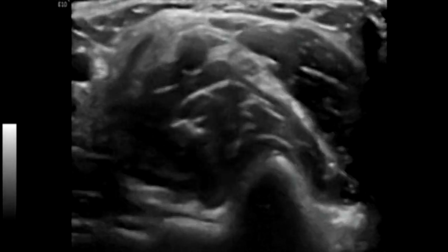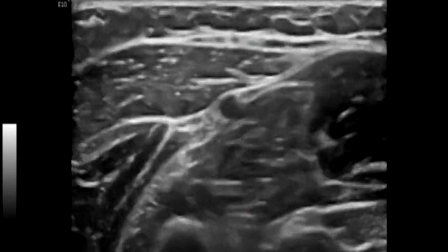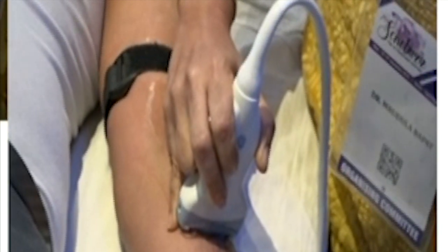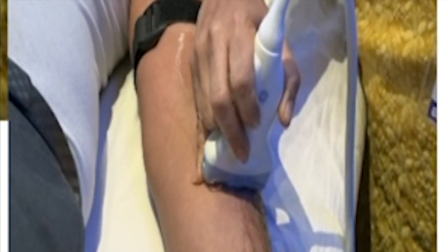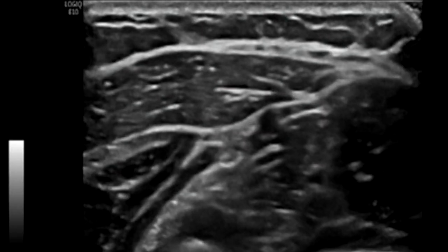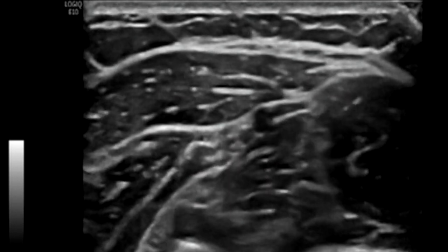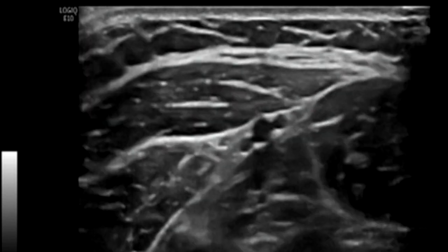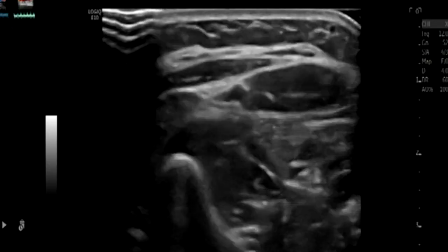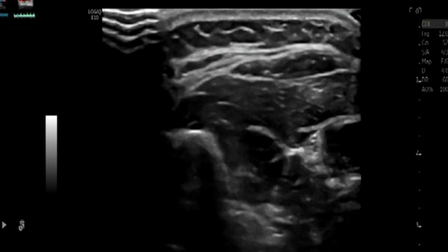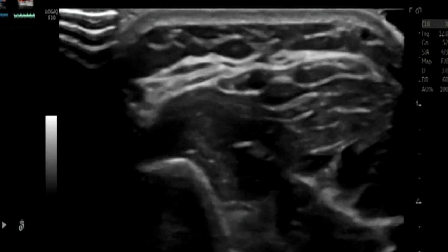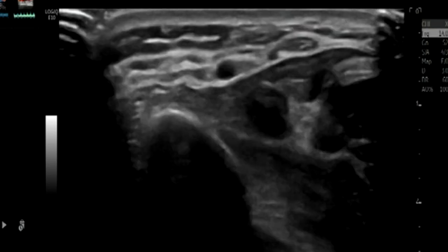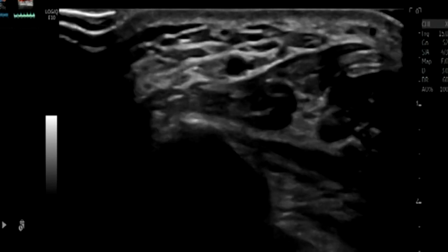You can see the brachial artery dividing beautifully into the radial, which is lateral, and the ulnar. Whenever starting the mapping, it's always preferable to start on the non-dominant arm — when the fistula is on the non-dominant arm, it's more convenient for the patient and for dialysis access, as the right hand is not involved. Then scan the radial artery from cranial to caudal. A distal radiocephalic fistula is always preferred as you get a longer segment of vein for future punctures.